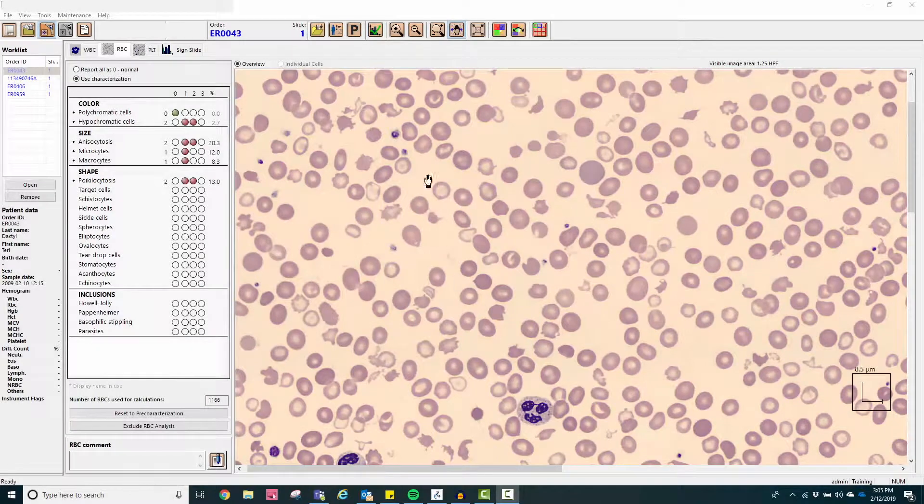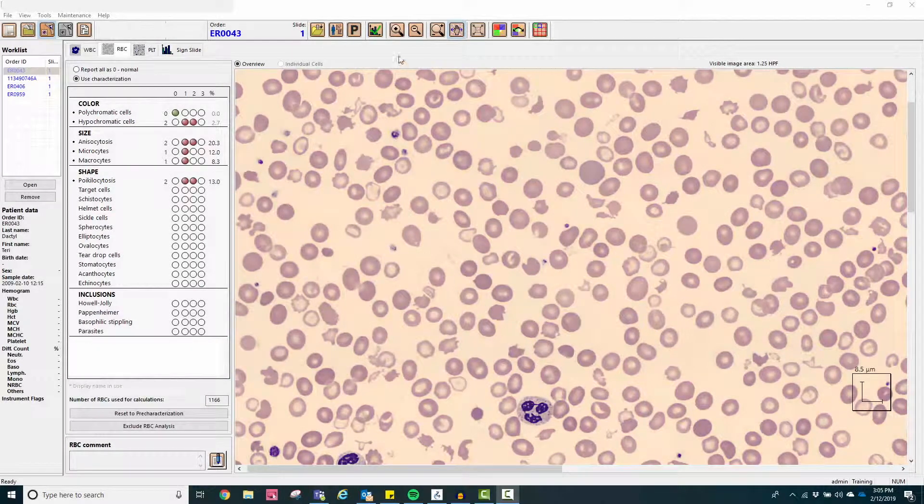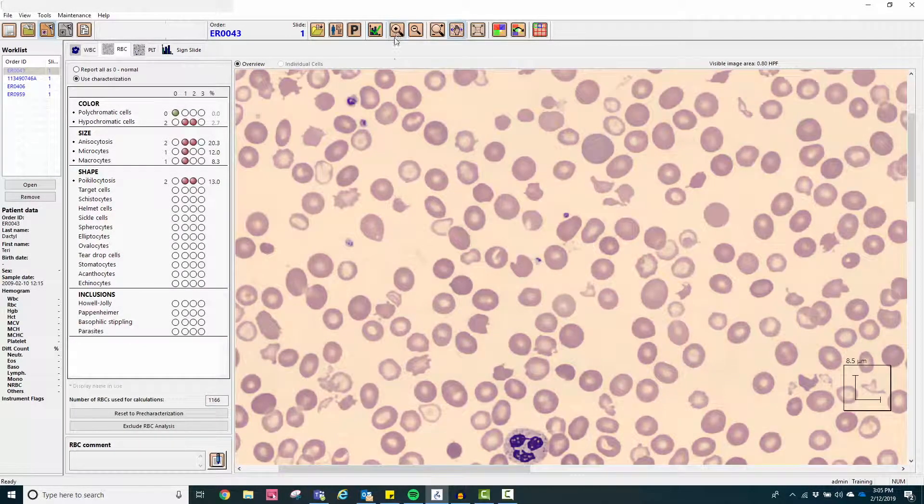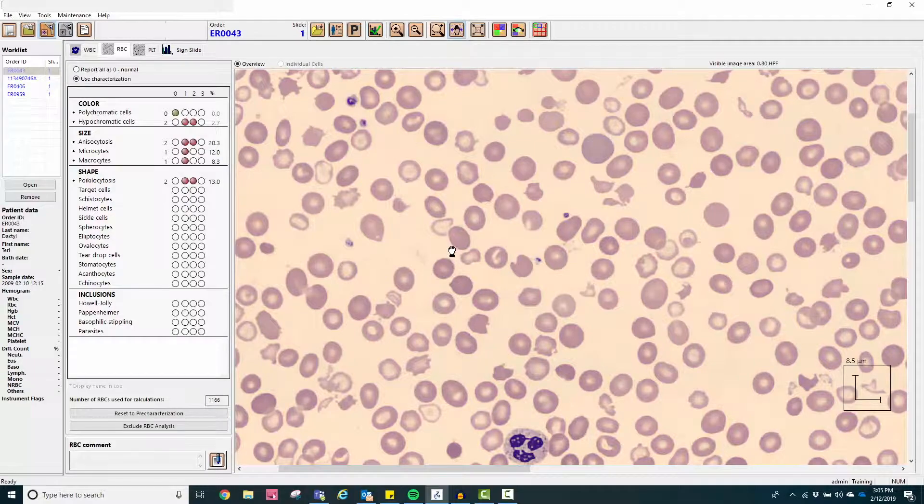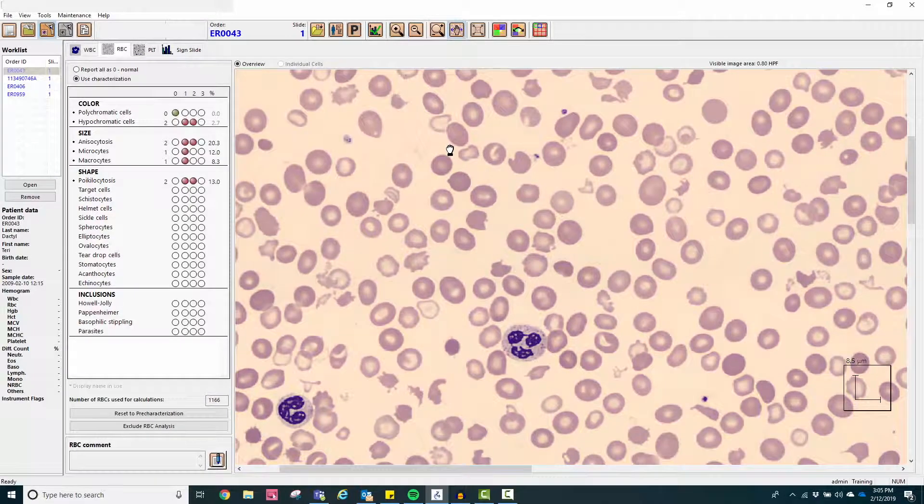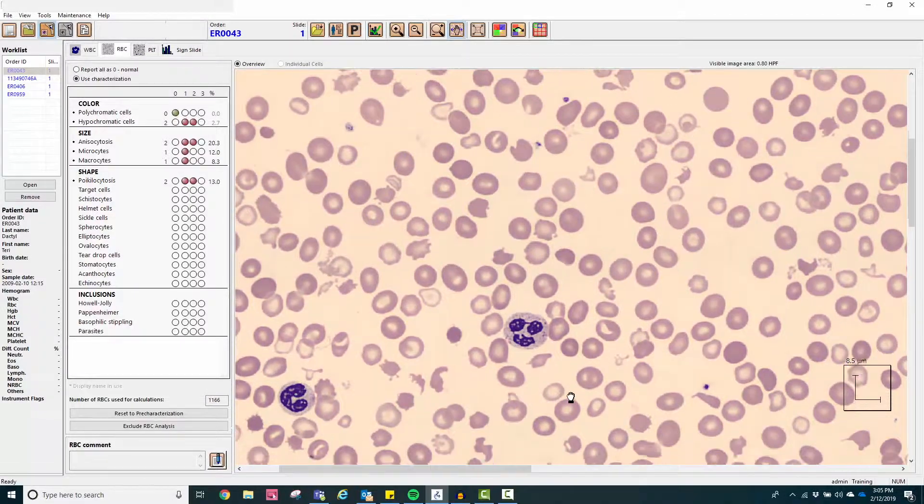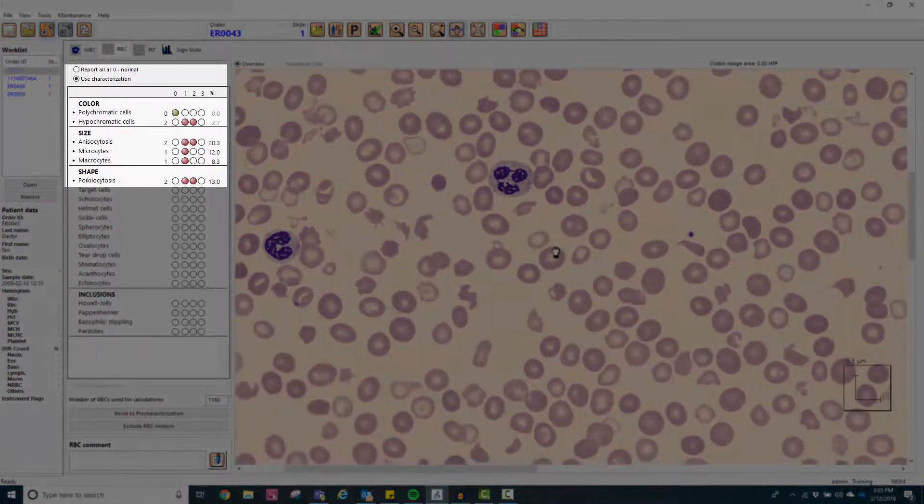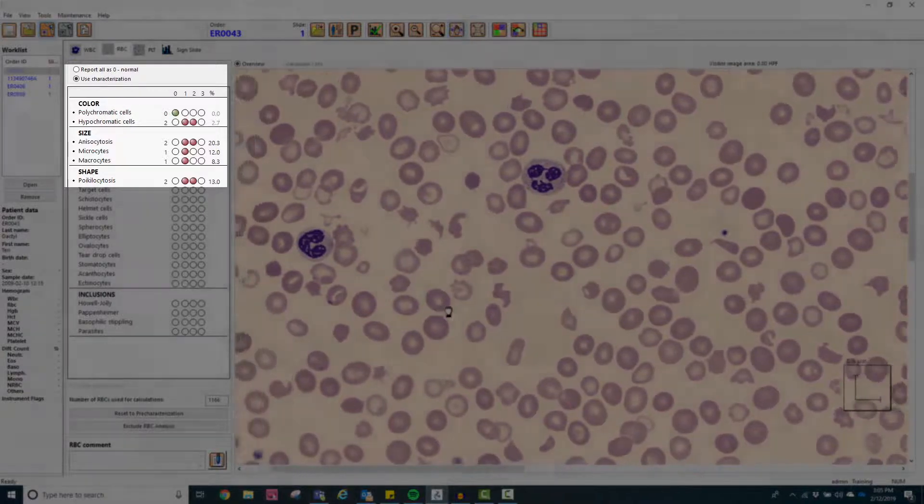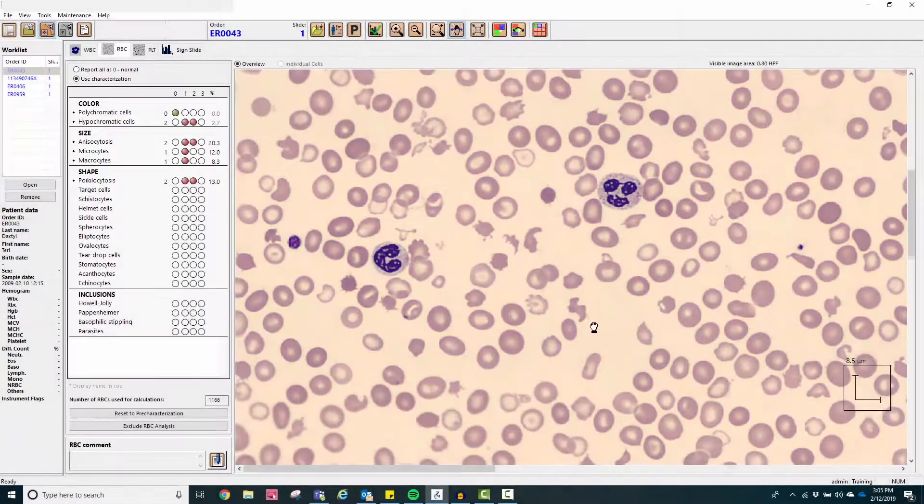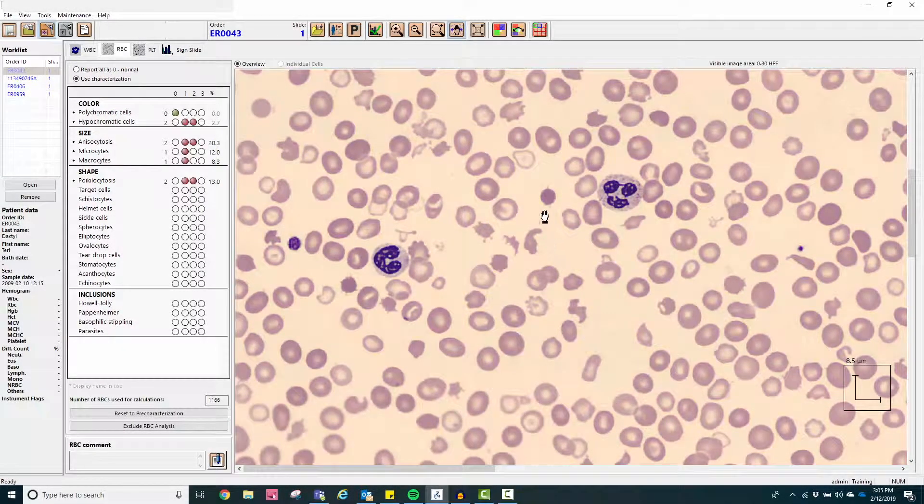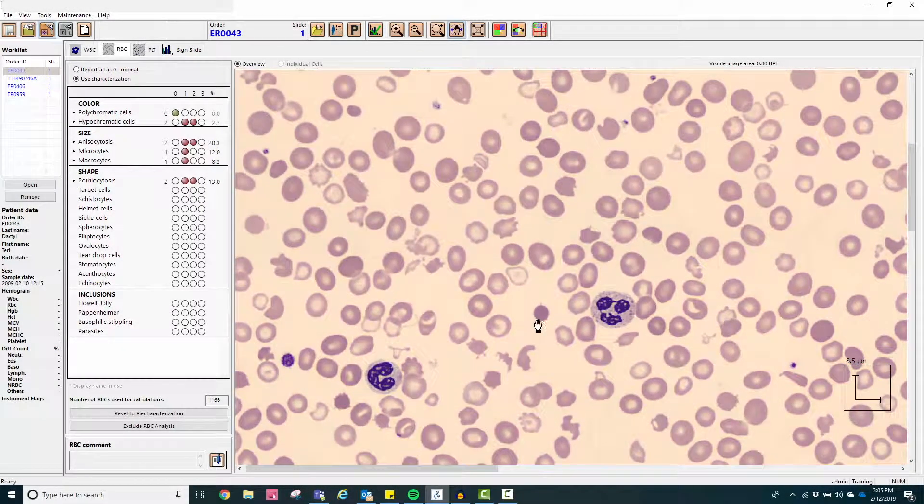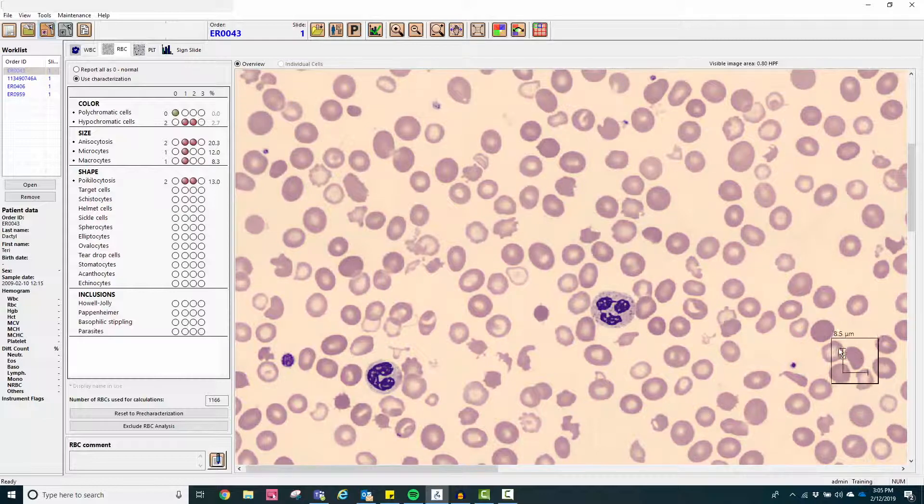The next case illustrates red blood cell morphology assessment. These algorithms evaluate the degree of hypochromasia, polychromasia, microcytosis, macrocytosis, anisocytosis, and poikilocytosis.